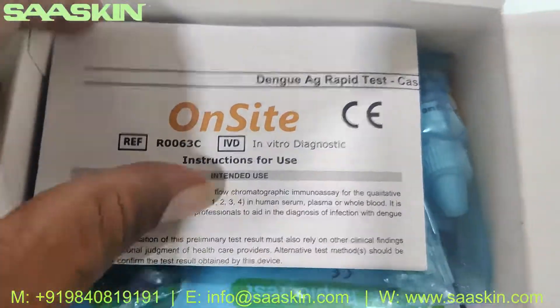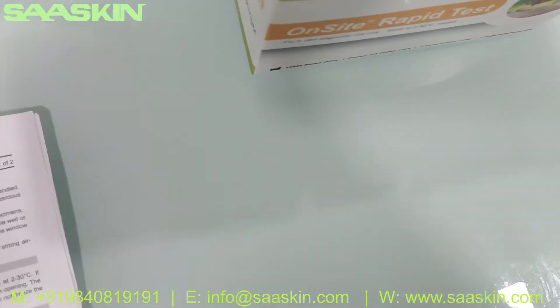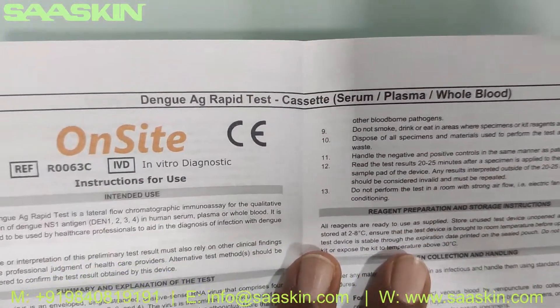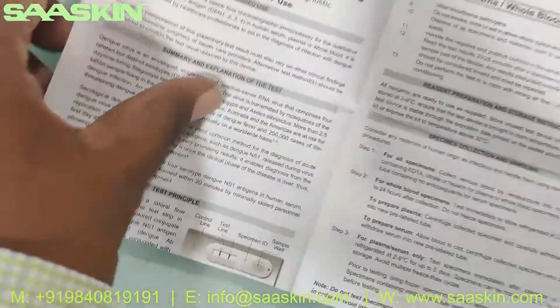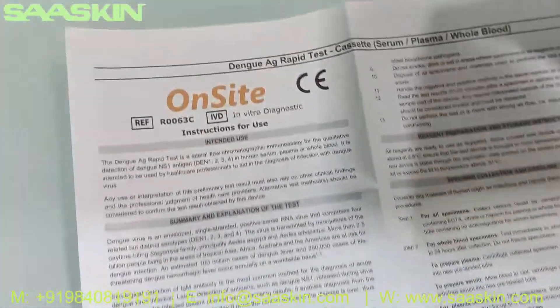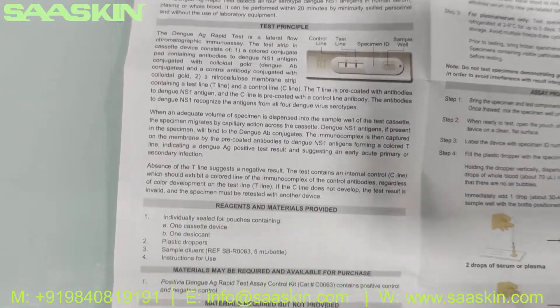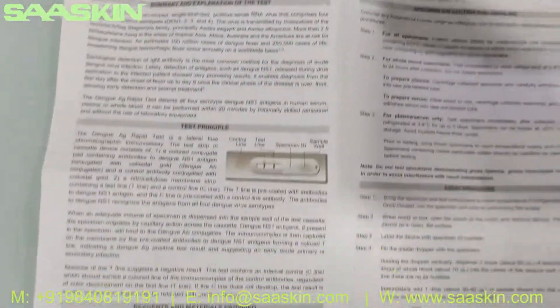There is an IFU brochure — here is the instruction manual. It says Dengue antigen rabbit test, on-site brand, and this is the reference part number. You can see this brochure has complete instructions, test procedures, and also the interpretation of the results.